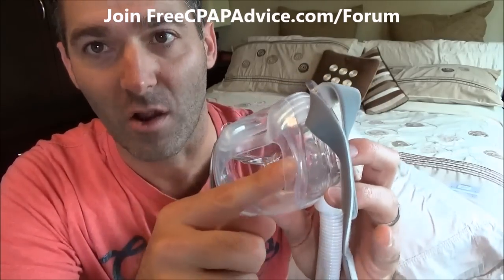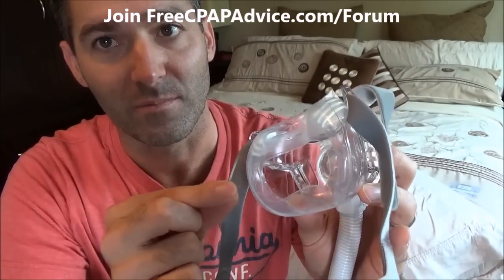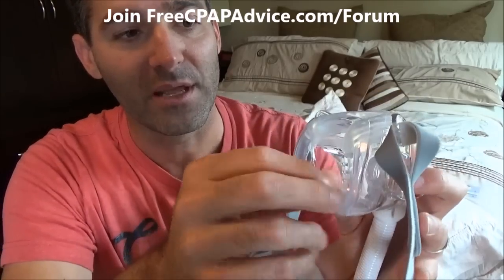See in here, there's like this hard ridge. There's a softer part here that makes the seal, but underneath that is a very hard silicone. It's unforgiving. It reminds me of the regular Amara. This is the Amara View, then there's the Amara. The Amara View has kind of the same properties where they have this silicone that is so hard and it has like a ridge in there that over time, finally to the last night, I was able to wear it for about 2 hours before I had to take it off because it was so uncomfortable around here.